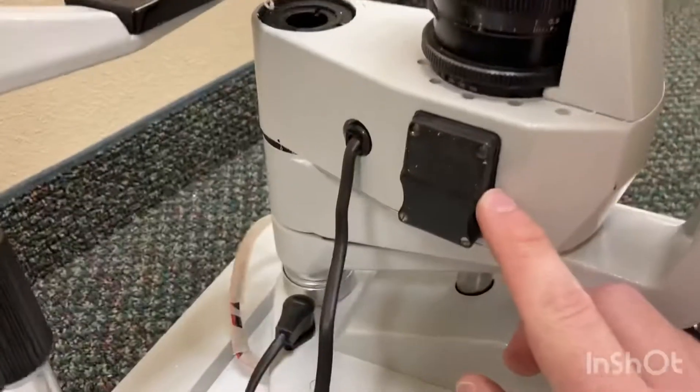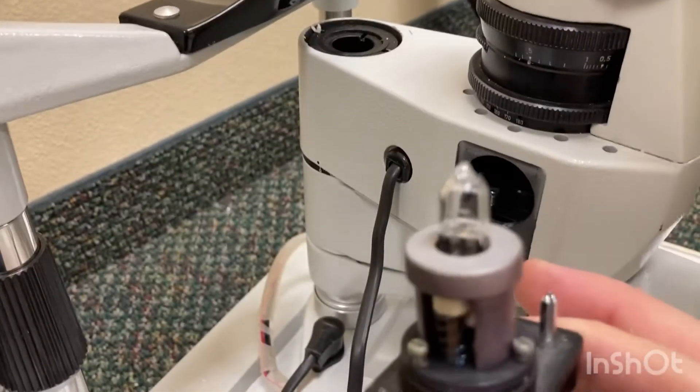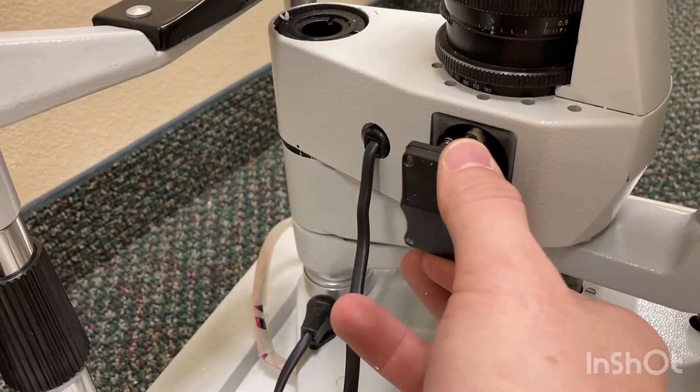This is where they hide the bulb. We pull that out and it's a plug with the detachable bulb, so you can just easily replace those whenever you have to. Then it just slides back in and it's on.